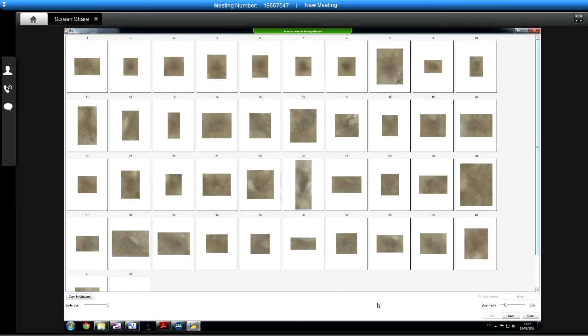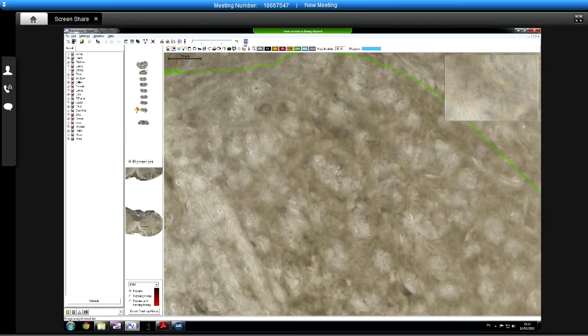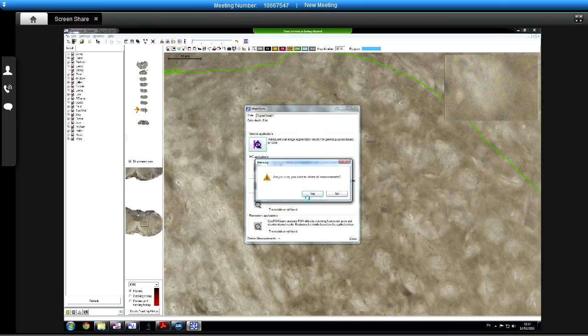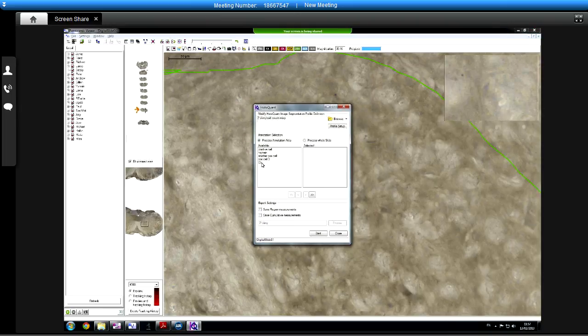We'll go back into this in a moment. So what we can do is we just go back in here. I'm just going to delete the existing measurements, and not go into that one actually. Go back into the training one, because you always want to be messing around with a small area. You can look at several small areas, but only one just now. Load in that profile.